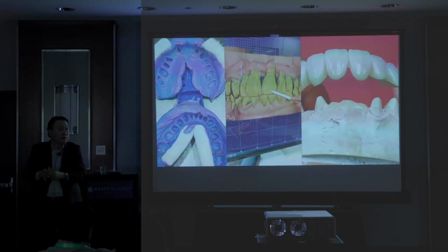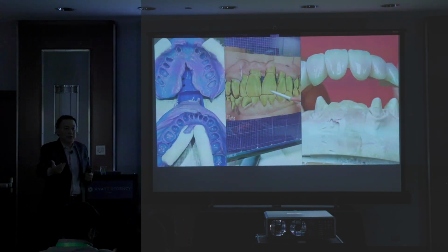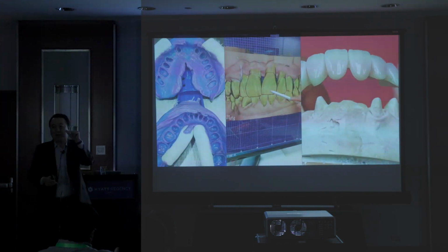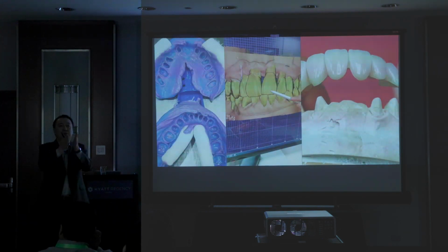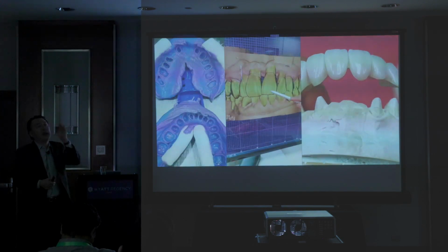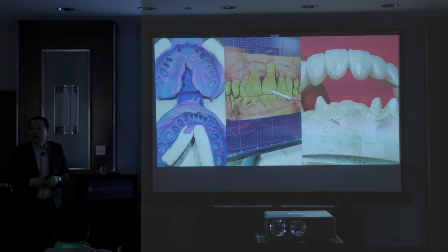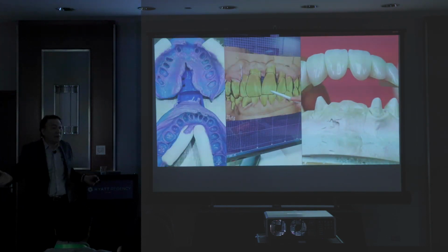Is that right? Is anybody a CAD/CAM designer here? Okay, so whenever you get the prototype, are you happy? Easiest way, just like copy mill. What do I mean by copy? Exactly copy, duplicate it, right? But if we think about the central, lateral, canine, premolar, do you know the occlusion concept? Do you know the anterior design? Oh yes, ExoCAD has 100 libraries. I told them, never use it.